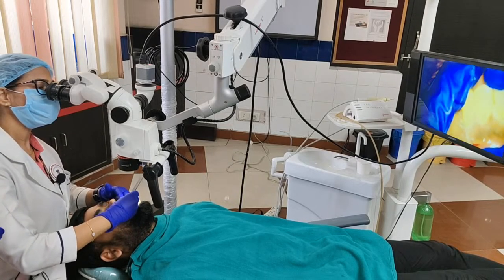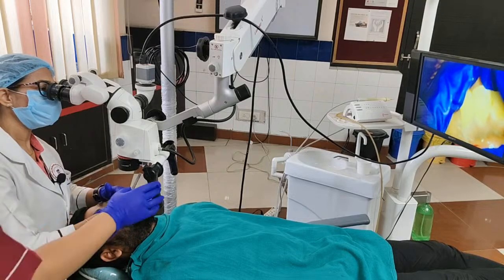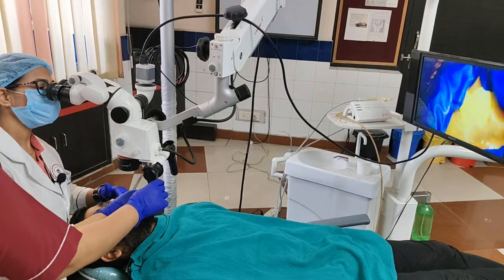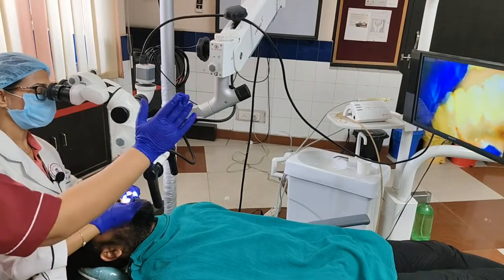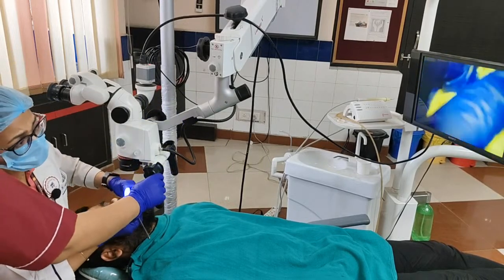Can we shift the working area to the center of the screen? You are doing depigmentation in the second quadrant, right? Yes. You can shift the patient away from you slightly.